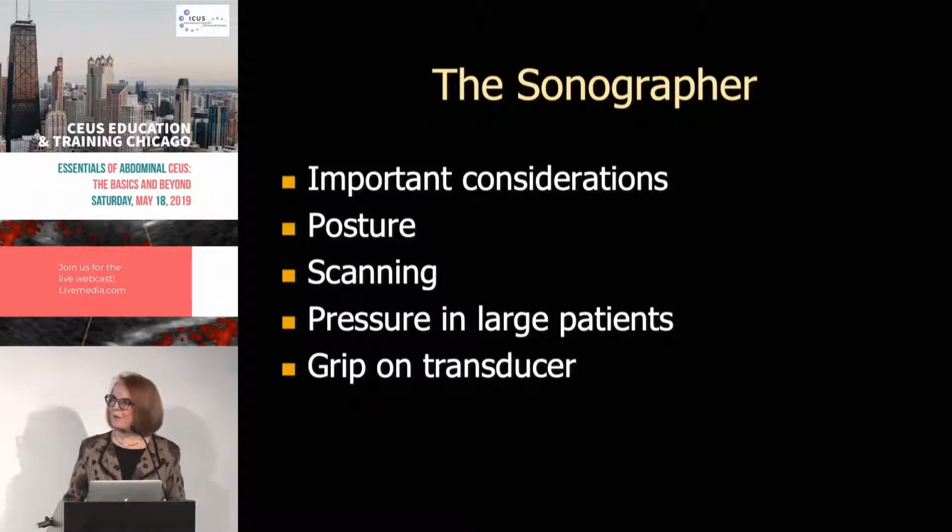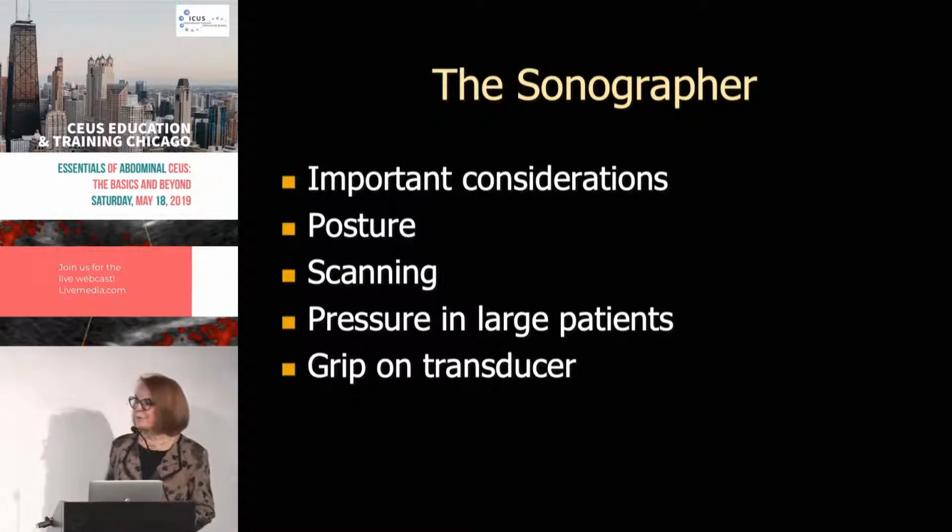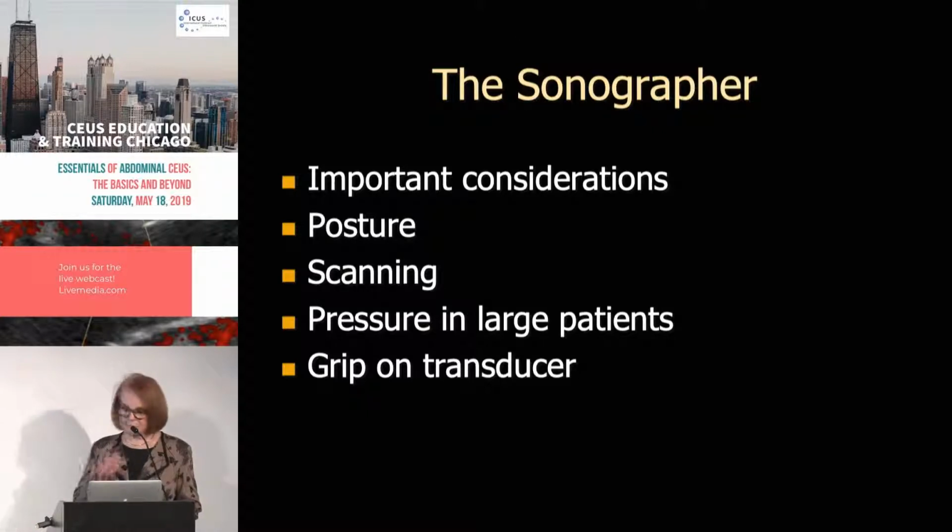Any questions about what we've talked about here? Yeah, sure. In HCC interpretation, I find the mild washouts sometimes difficult to be definitive about. And with LI-RADS, you need to be definitive to have that 100% specificity. Sometimes, is there a washout, is there not? I find myself being a little wishy-washy. Do you have that? Yes, of course.